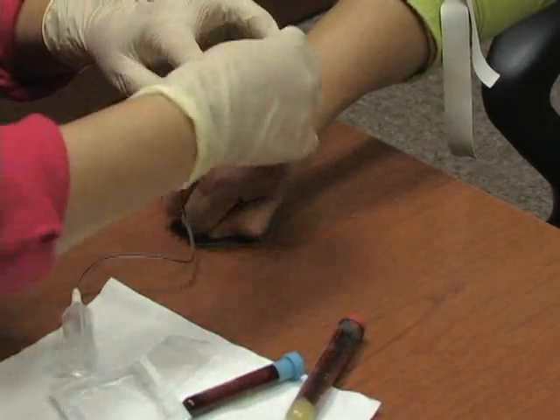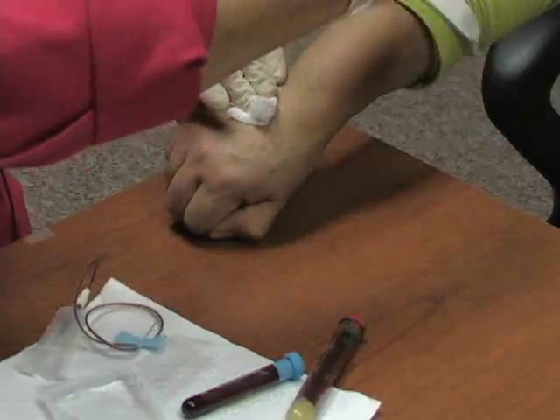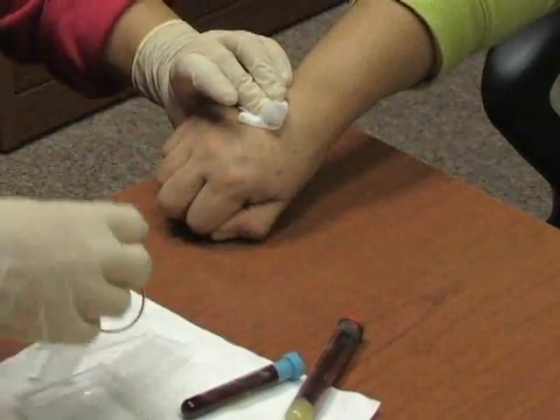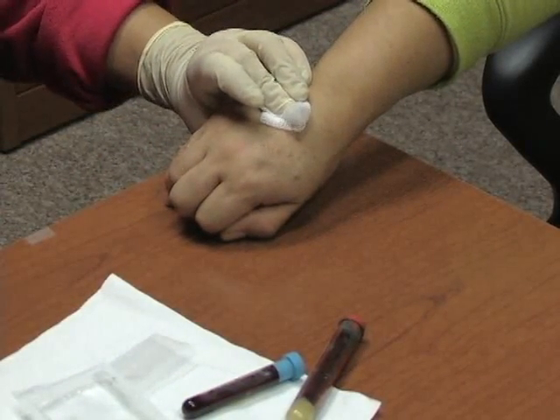Now that I've drawn my blood, I can put a piece of gauze over the site, remove the needle, remove the tourniquet, and we're all done. Take my needle and, of course, put it right in my sharps container, which is right handy.